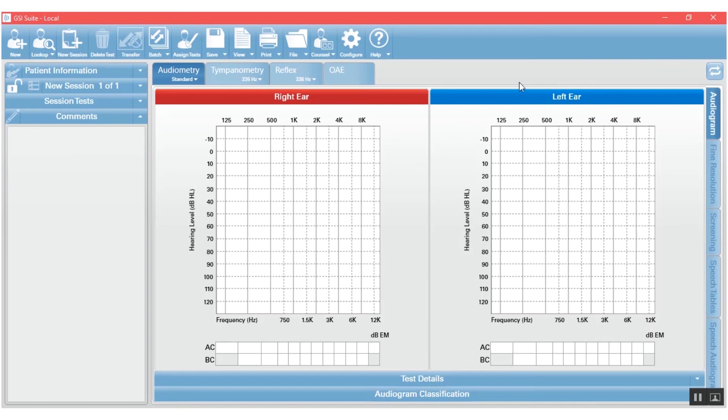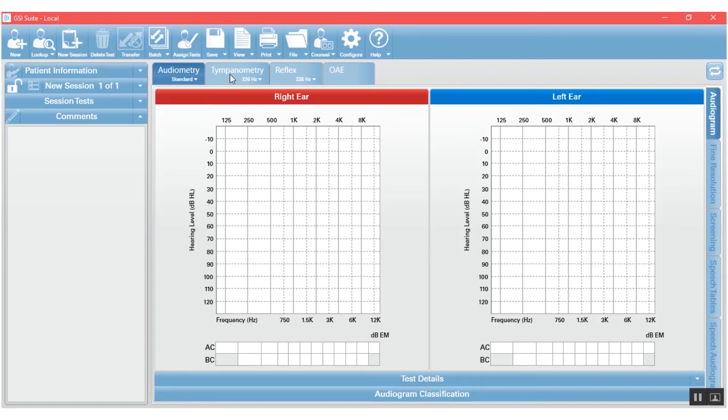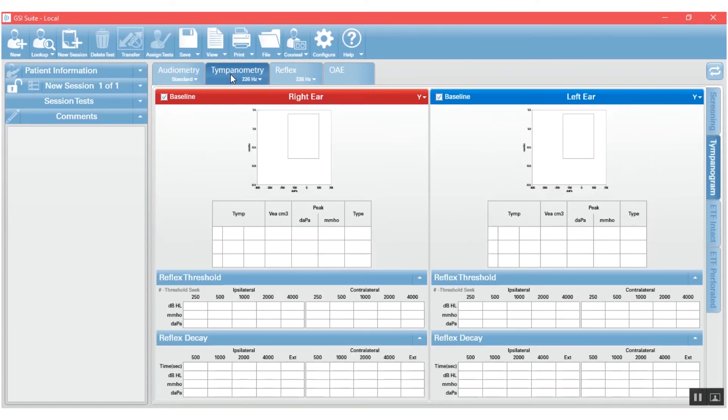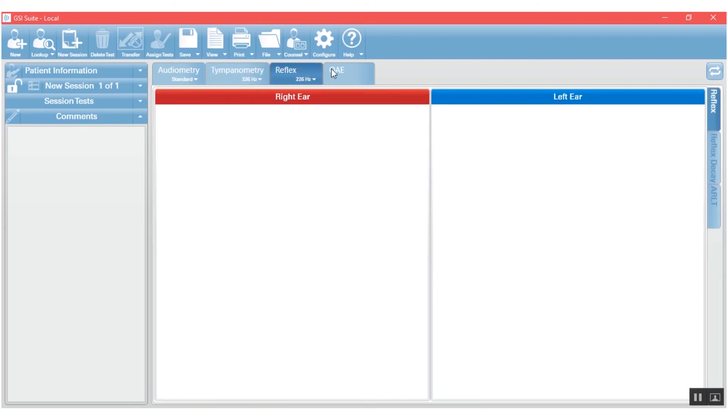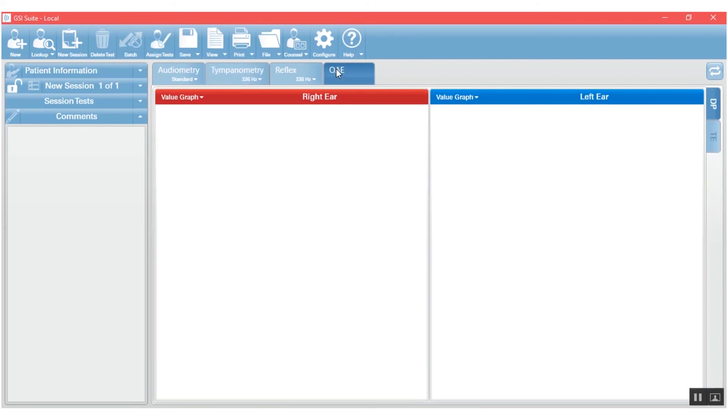The third section of GSI Suite is the data area. So this is where all of the test results that are transferred from the GSI equipment will be housed and displayed. You can see that it is actually separated into the different test types. So we have one tab for audiometry, one tab for tympanometry and reflexes. They're separated. And one tab for otoacoustic emissions.